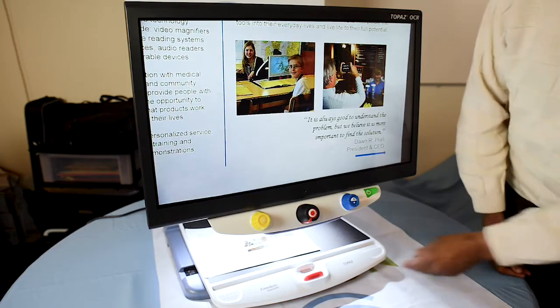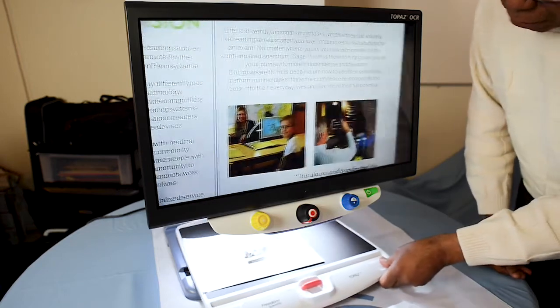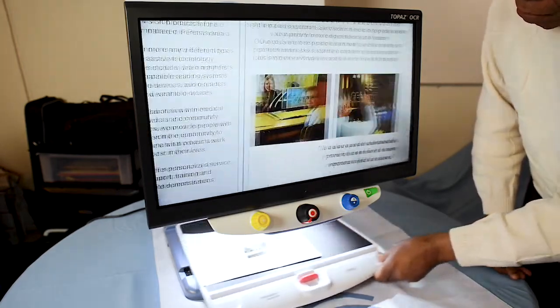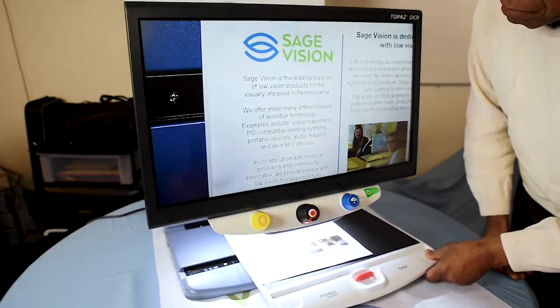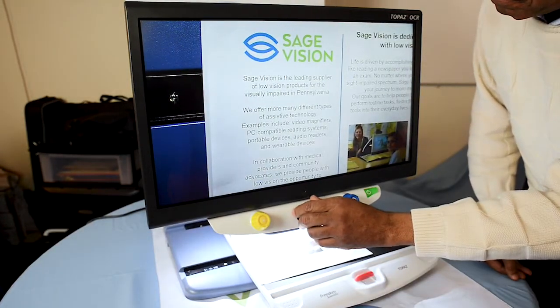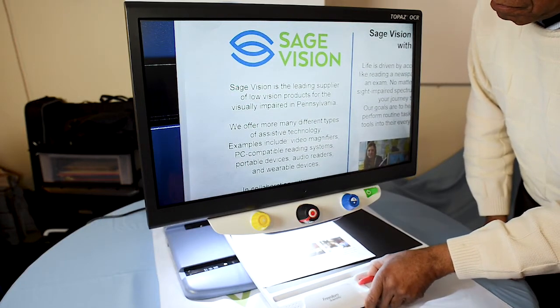It's called an XY table because it is able to move up and down and also left to right. You can place a newspaper under here, zoom in as far as you'd like, and adjust the table as you're reading along the document.